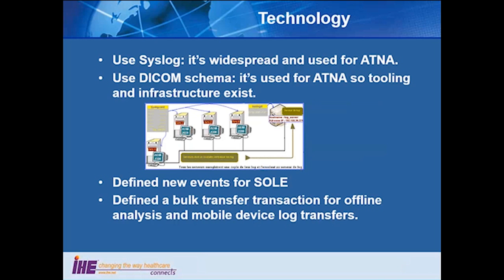And what changed is the existing schema already tracks who, what, where, and when an event took place. And what we had to do was to add event codes that are not security events and not security or privacy related events.